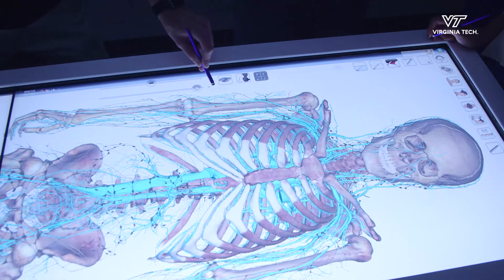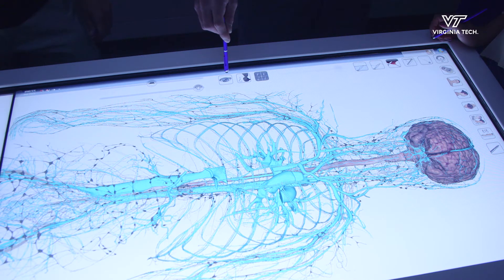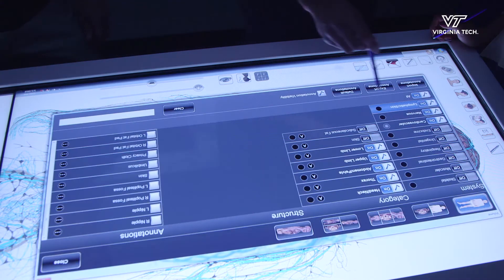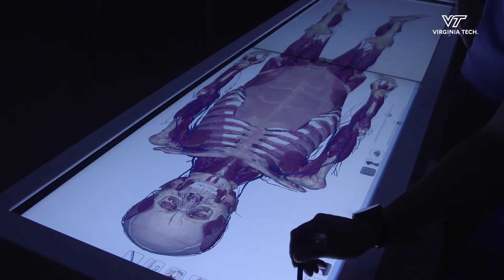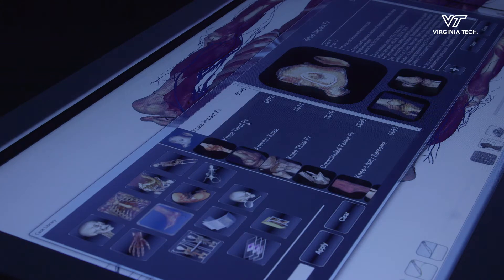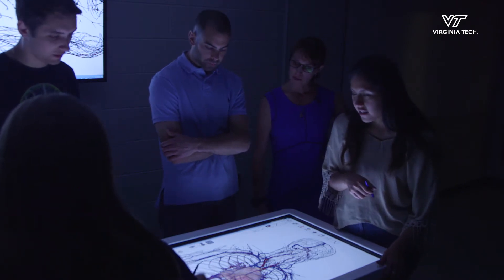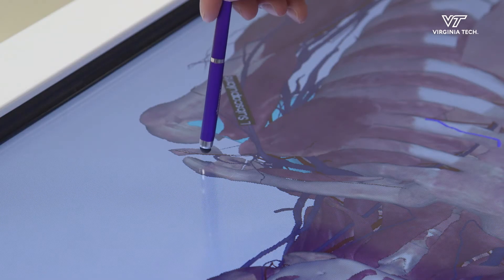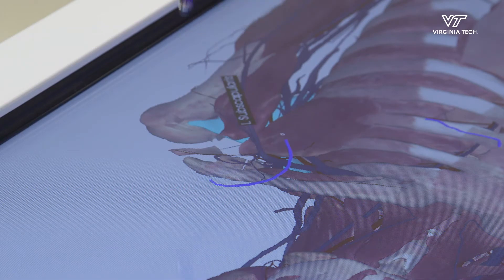Everything they have so far is on a computer screen, and this allows them to go life-size — to look at the cadaver itself, to look at the CT images. There are some different case studies in here that they can work through. Students can build presentations. It's more of a realistic feel for what they're going to see in their next level of training.